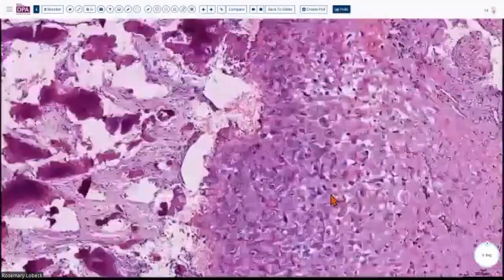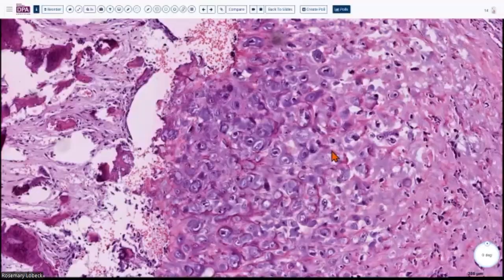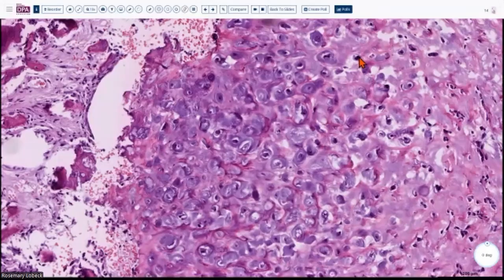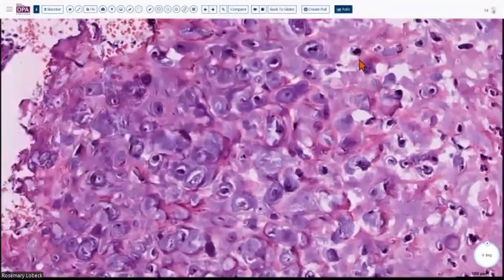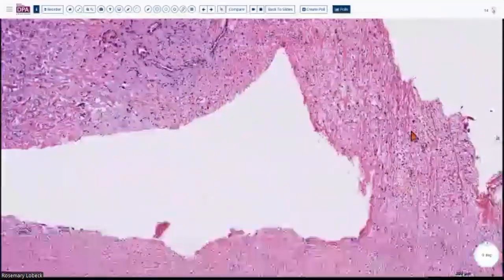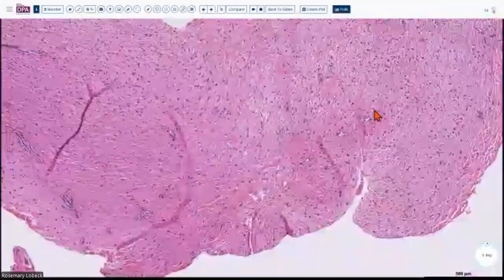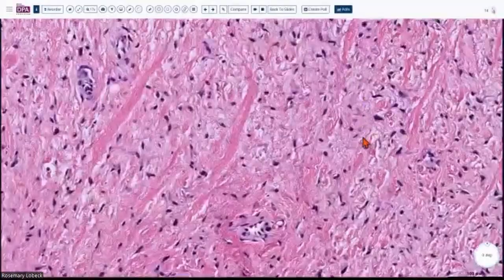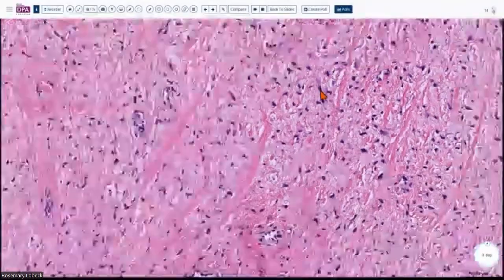But when you look closer at the cartilage, the chondrocytes here, there is something wrong, right? Because in an osteochondroma, if you look at the cartilage cap, you will see these lobules or clusters of chondrocytes. But it's all so irregular over here. And you can also notice that some of these chondrocyte nuclei are starting to look atypical, very dark, right? And then you pull back and look at this so-called perichondrium. So what is actually going on here? It's way too thick, right? And it is cellular. And if you zoom in, you will see the same atypical, very dark-looking cells, okay?